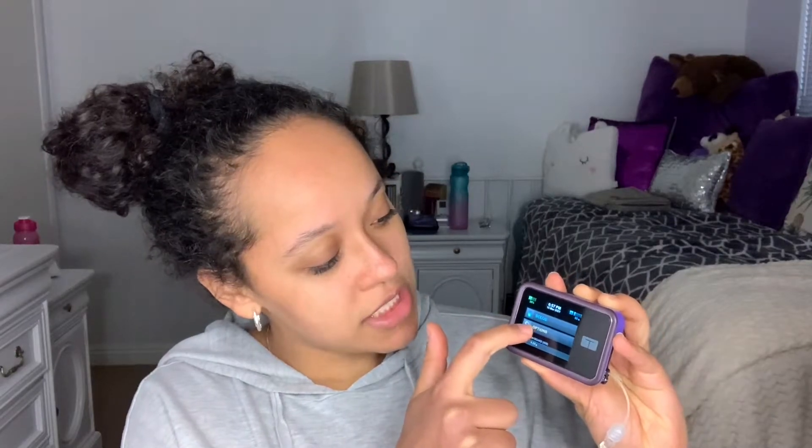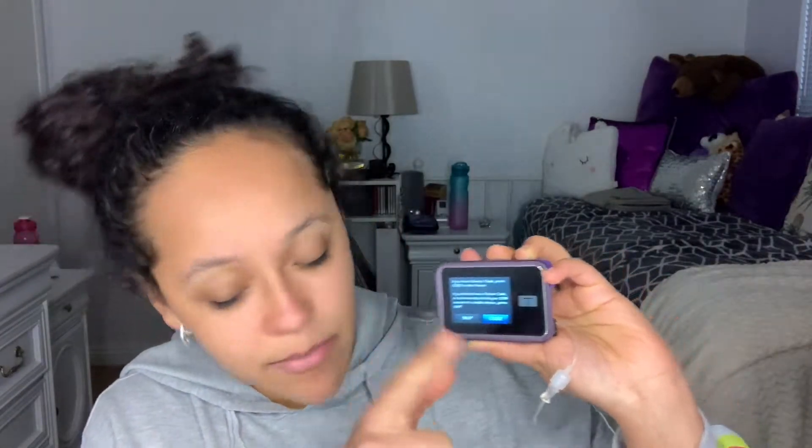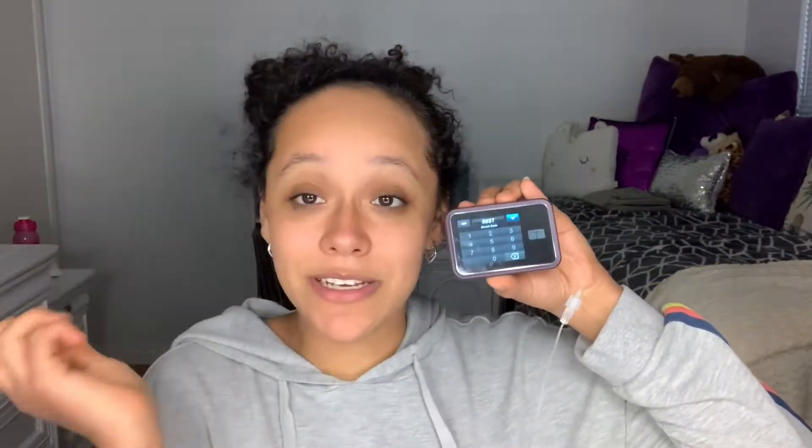So first things first, I'm going to go into my pump, go to options, and go down to my CGM. Then I'm going to see a button that says 'start sensor.' I'll go there and it says either skip or code. The code will be whatever number is on the sensor part right here — so just put that number in. Now don't press the check mark just yet because we have to get this thing attached to us first.